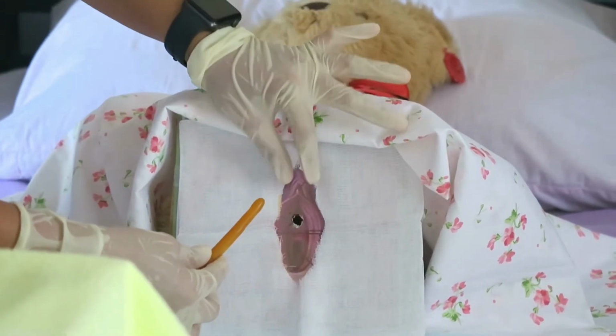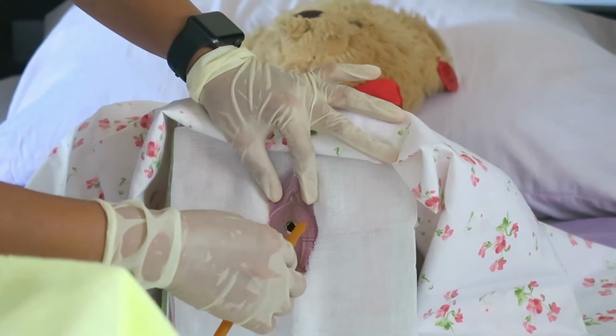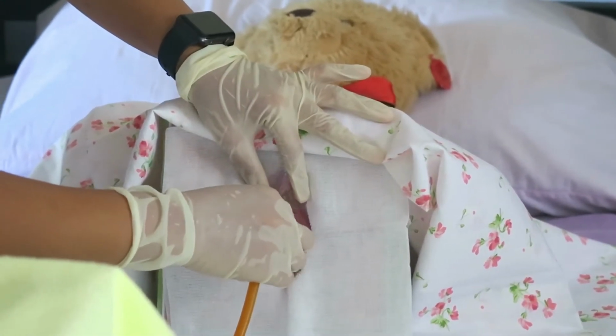So, ma'am, I will touch your genital area and I will insert the catheter. Is that okay? Okay, ma'am, thank you. 1, 2, 3.